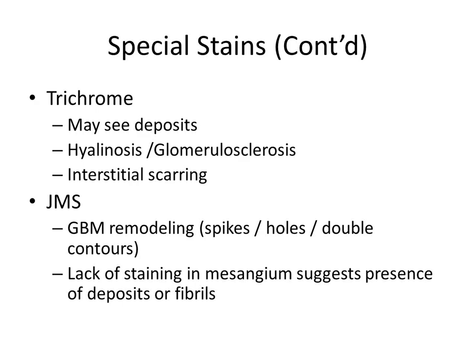The Jones stain, I've had a couple of people ask me why we always do a Jones and not any other silver stain, and I don't know exactly how this stain differs protocol-wise from a GMS, but I do know that a Jones has to stay in the silver for quite some time. And so that silver method is actually getting impregnated into the collagen. I think that's the word I'm supposed to use for that. So the Jones stain is really going to help you evaluate remodeling of the glomerular basement membrane. And if you don't have a good quality lab that does the Jones well, it's probably not worthwhile to do it.